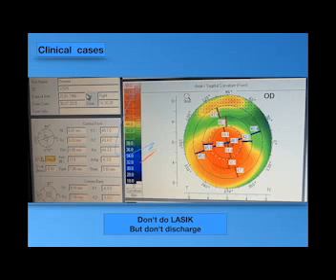I have an irregular cornea. In the same circle, I have a K reading of 45.6. In another point on the same circle, I have 50.1 diopters. Implanting the ring will not smoothen the cornea, in my opinion, will not smoothen the cornea at the same level in all points.